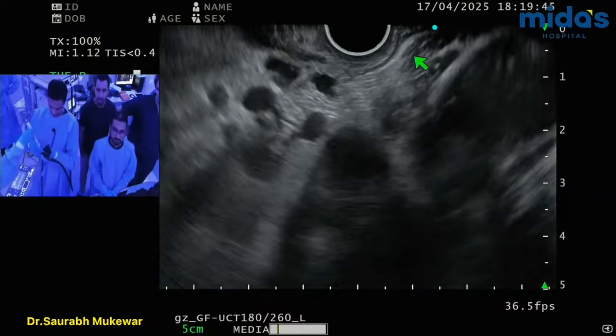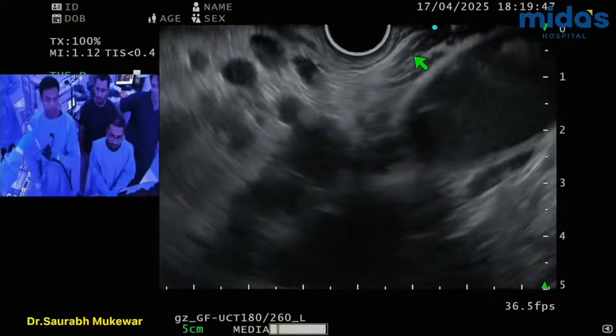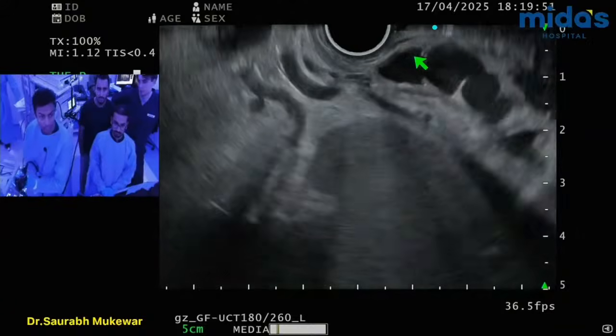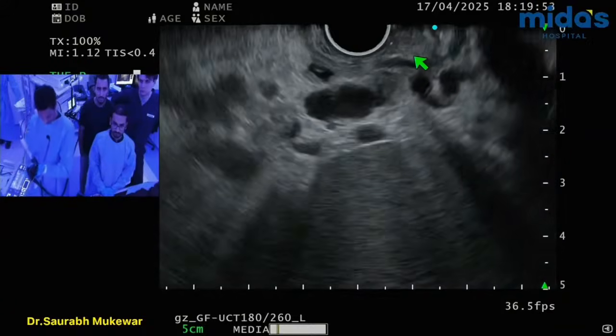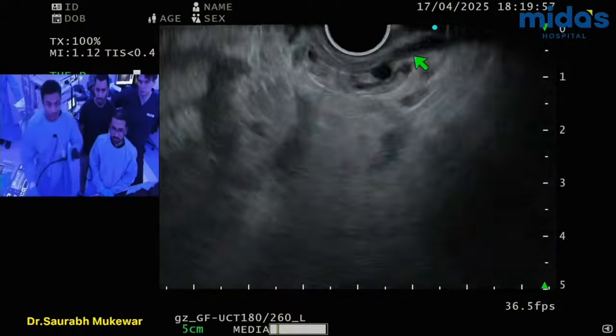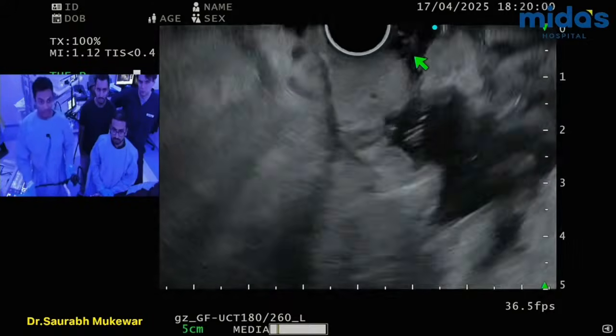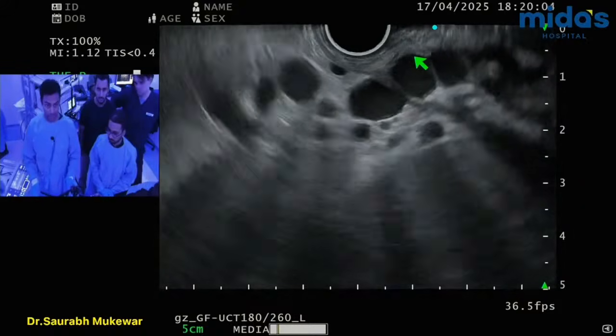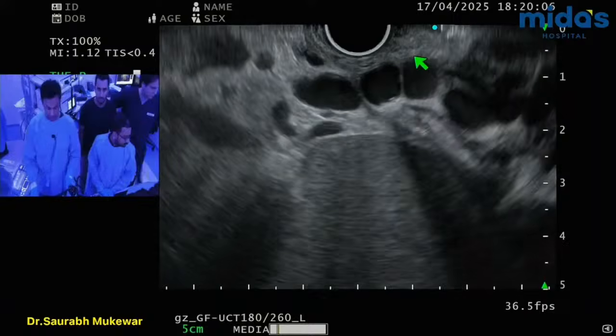I'll show you how. Obviously the position is a little odd because I have to do it either this way or go all the way down and see if that gives me a better position. Can you do it this way? Okay, can you increase the height of the bed?